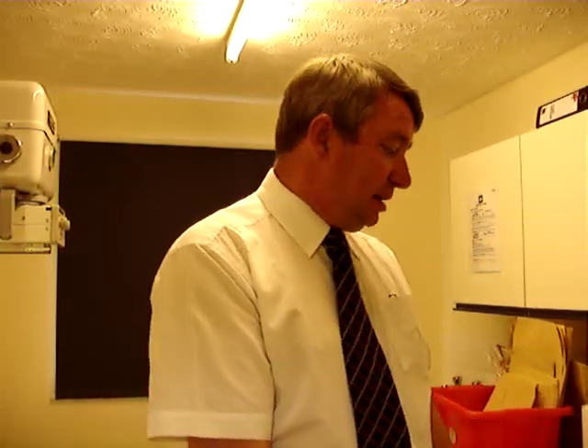The same applies to us — they use different gadgets for echos, and the one they use for abdominal scans looks, to my untutored eye, to be very much the same as that. There are no bespoke veterinary machines that I'm aware of — these are all human machines. The problem with ultrasound though is that it takes skill, over many years, to interpret the image. When I got my first ultrasound machine I nearly sent it back because the image was all fuzzy and I couldn't see it. But that's the nature of them.